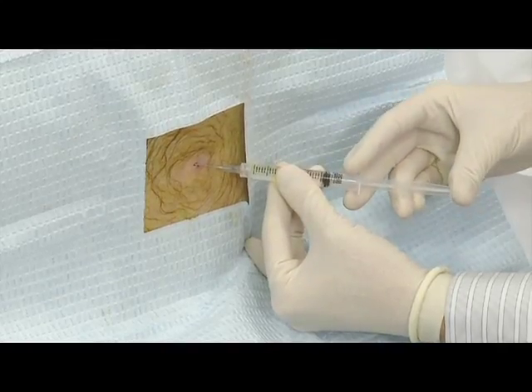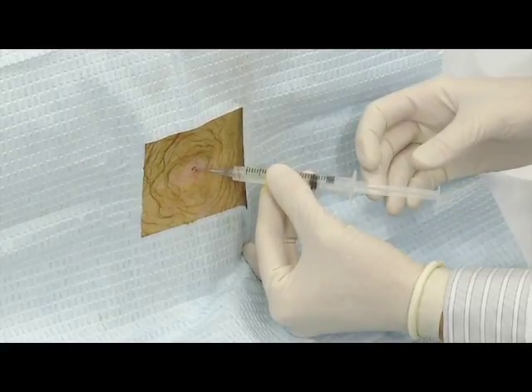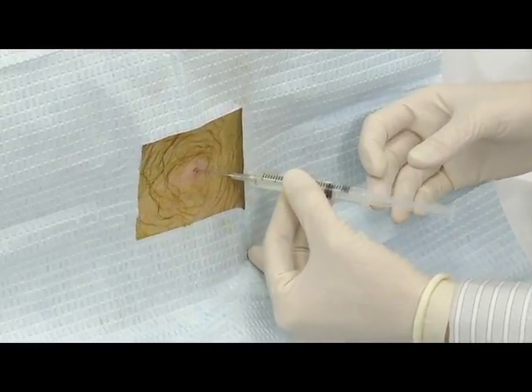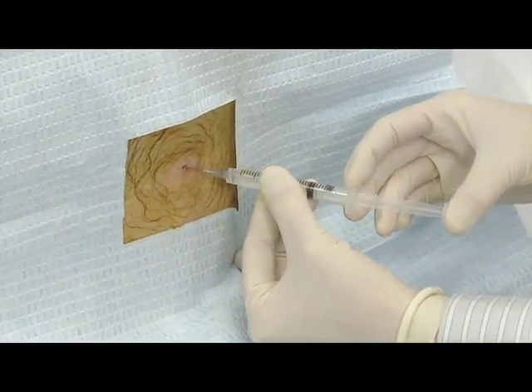With each advancement of the needle, pull back slightly on the plunger prior to injection to ensure that you are not injecting into a blood vessel. Continue this process as you advance the needle to as deep as the needle allows.